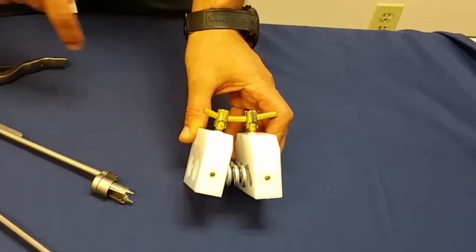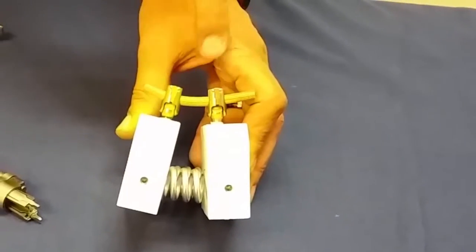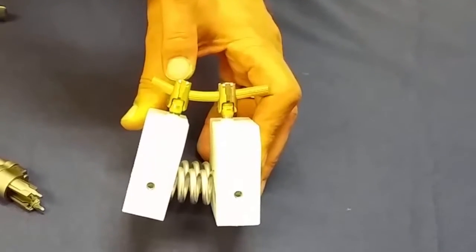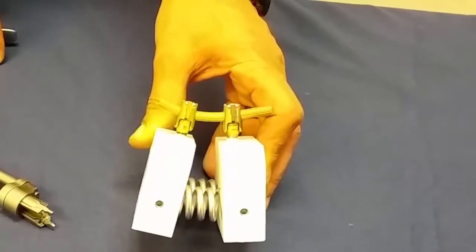At this point we have other instruments to be used as counter torque instruments for final torquing the set screws or the locking caps to a torque value of 95 inch pounds.